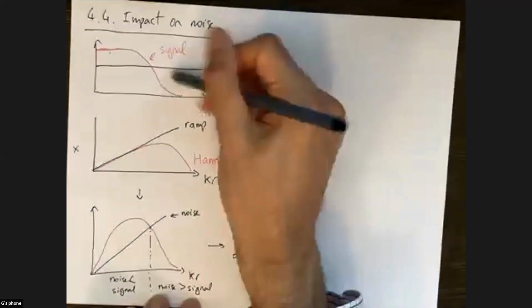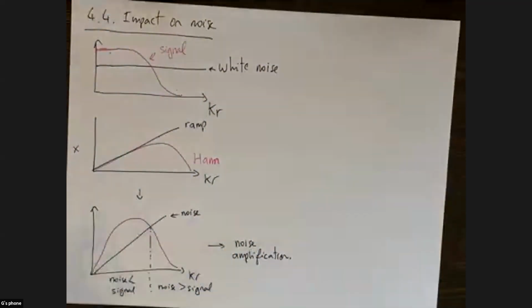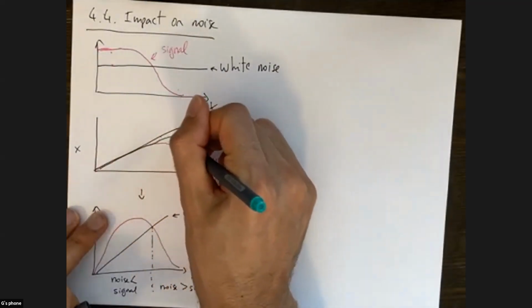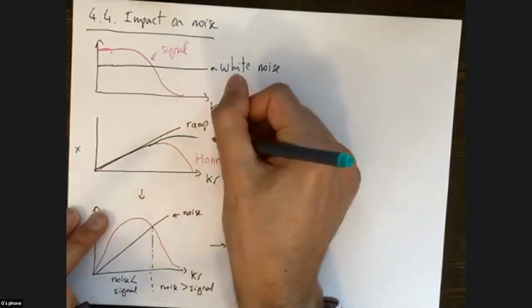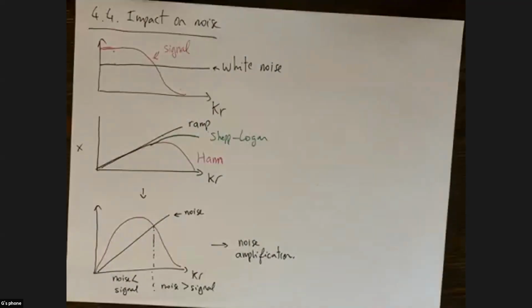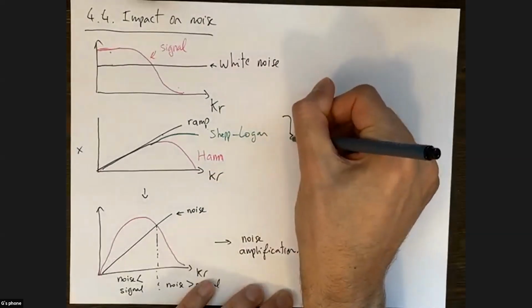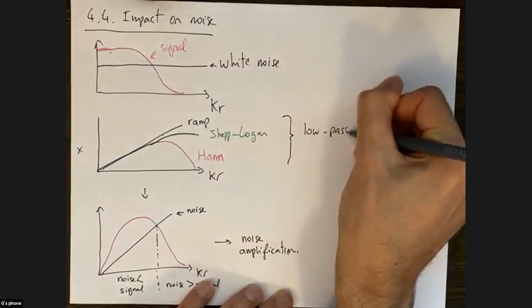Therefore, the noise that's present in the high frequency part of the spectrum will not get emphasized. There are other variations of this, of course. There's another one that's more like this, called Shepp-Logan, which reaches more of a plateau instead of going all the way back down to 0. And so on. What this is referred to globally is noise rejection, also known as low pass filtering.